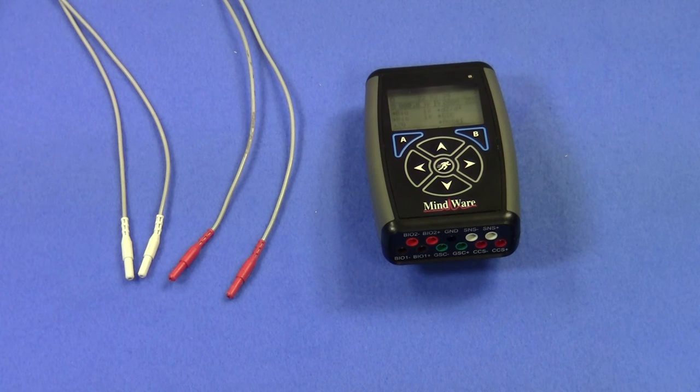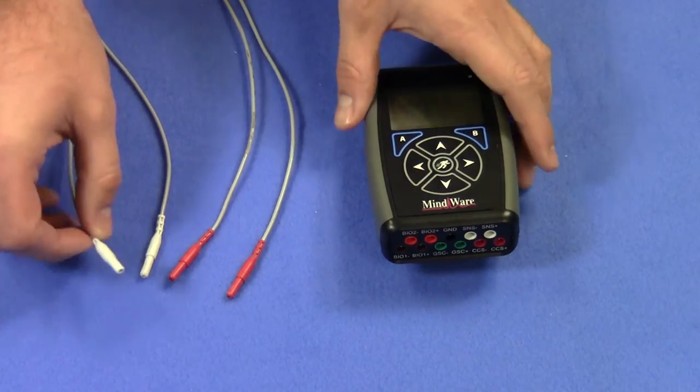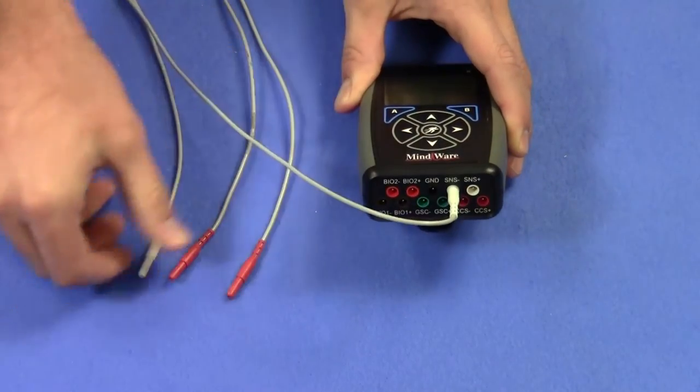Once the electrodes have been placed, the leads can be plugged into the data acquisition device, such as the MindWare Mobile. You can see the color of the leads corresponds with the color of the channel.